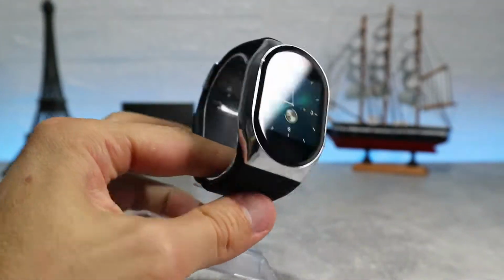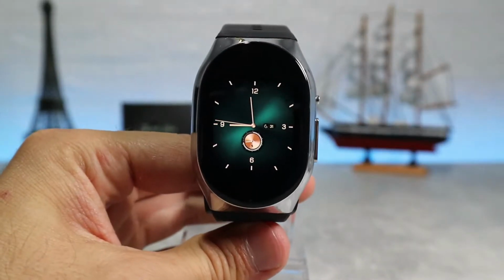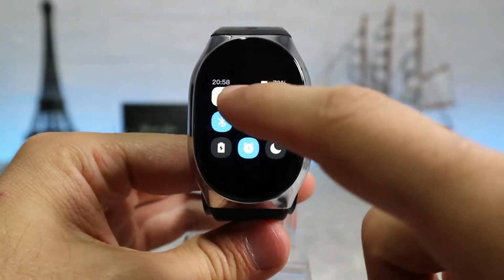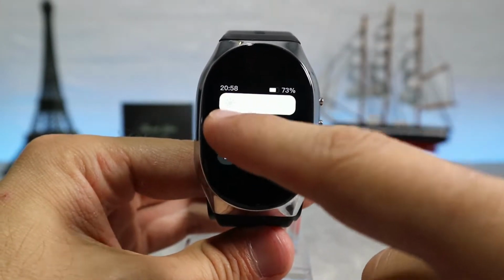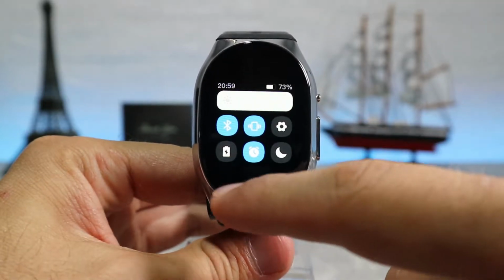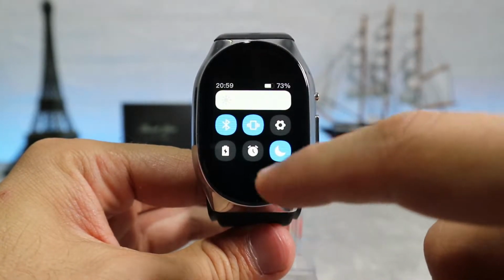So, let's go inside and see what options and apps we have on the BP Doctor Pro. If you swipe down you have the option to set the brightness level, turn Bluetooth on and off, and also activate vibrate mode, power saving mode, alarm clock, do not disturb, and settings.